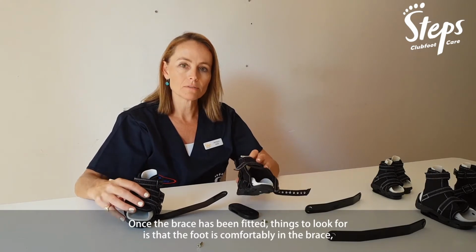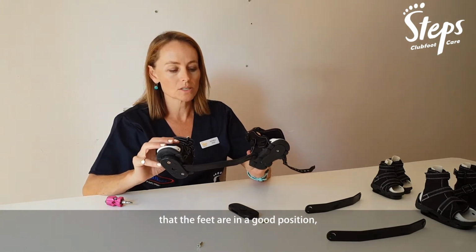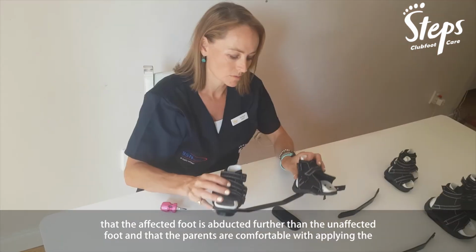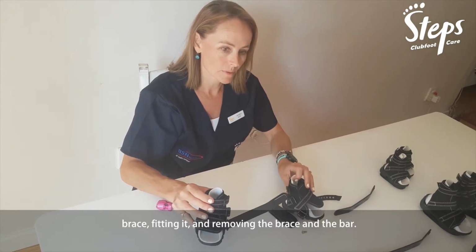Once the brace has been fitted, things to look for are that the foot is comfortably in the brace, that the feet are in a good position, that the affected foot is abducted further than the unaffected foot, and that the parents are comfortable with applying the brace, fitting it, and removing the brace and the bar.